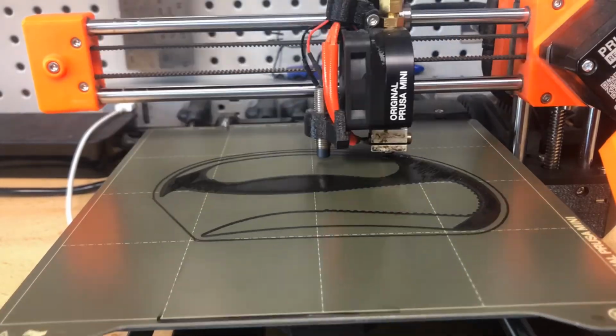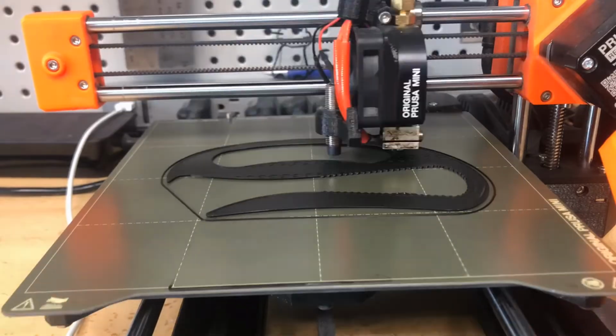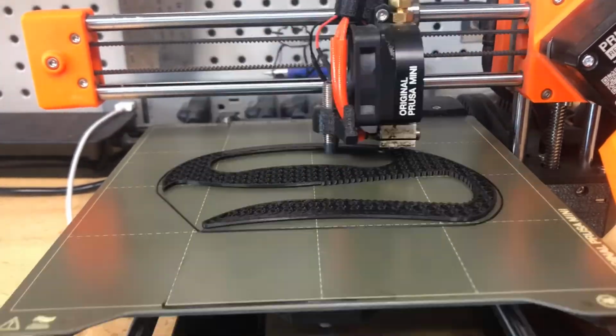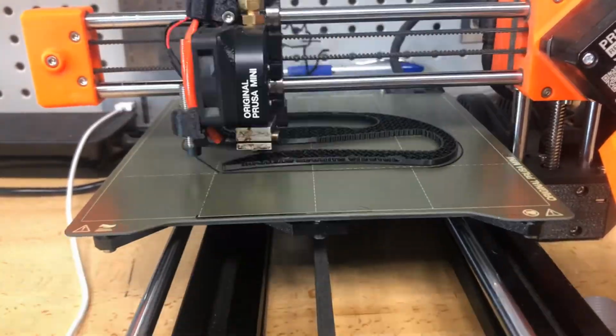And I've actually got a quick time-lapse of this print going off on the little Prusa Mini at my local makerspace. In reality, this print took around 2 hours to complete, but because I was prepared and I'd printed it ahead of time, I was able to focus on other tasks while it was printing in the background.